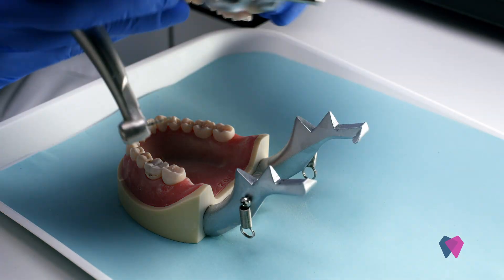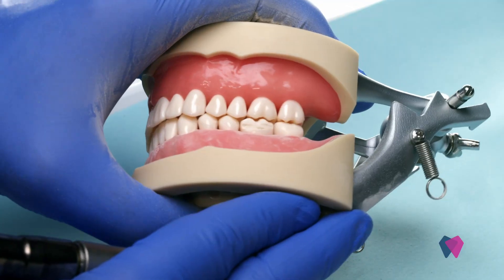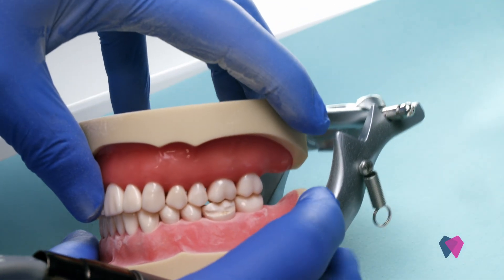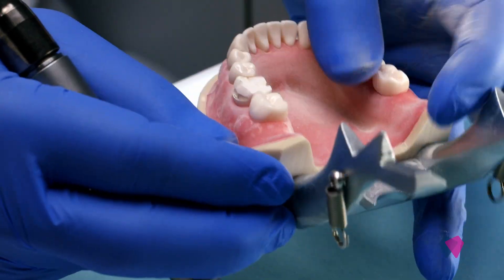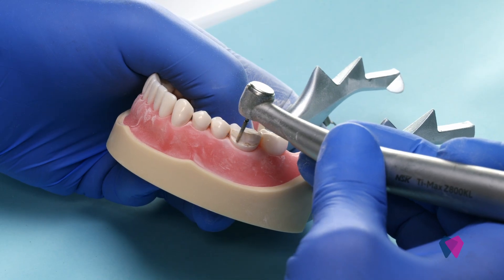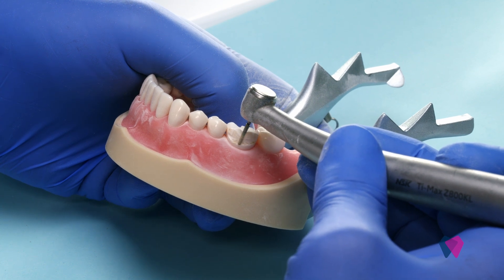Now you can have your patient close and look at the amount of reduction. Make sure that you've got about 1.5 millimeters here. Remember, we've still got more to reduce.